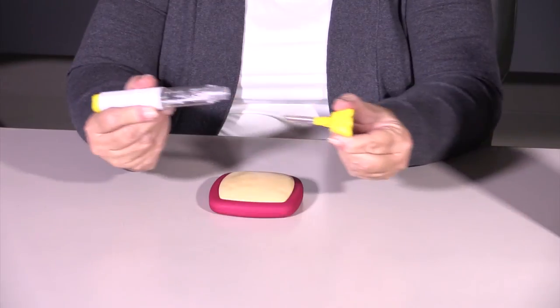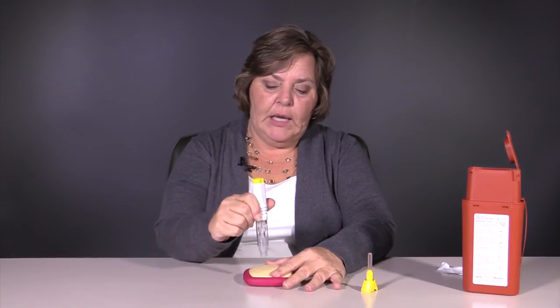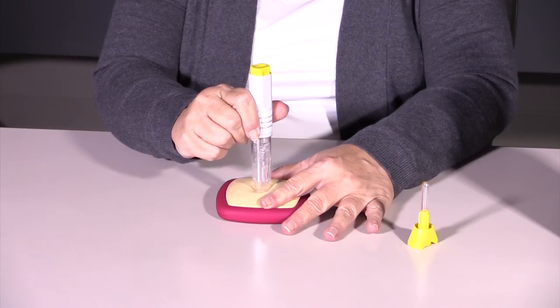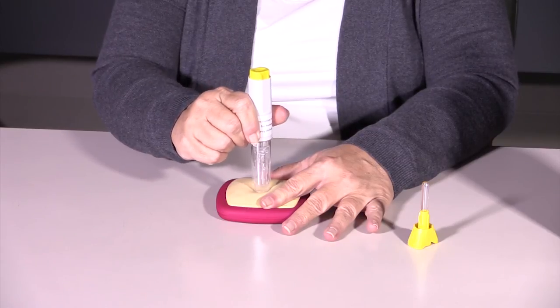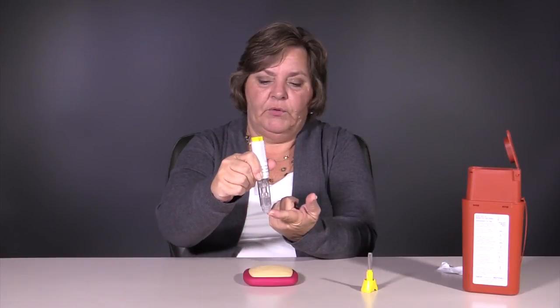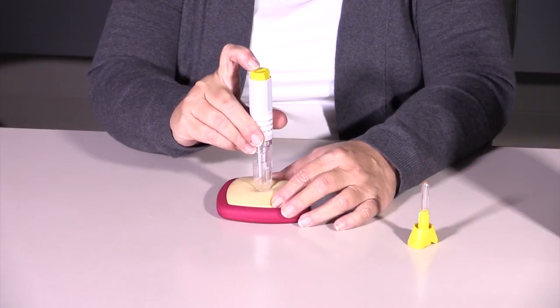Then you're going to take your Resuvo and pull out this yellow clip. You can pinch the skin, or it may not be necessary. But at any rate, you're going to apply gentle pressure at a 90-degree angle until you see this section depress. You'll feel that depress. Once that's depressed, you click the yellow button.